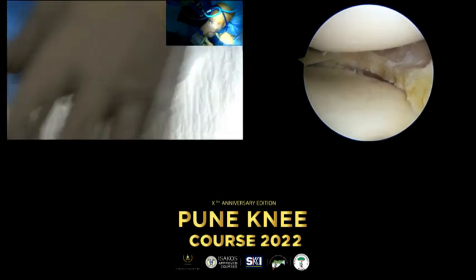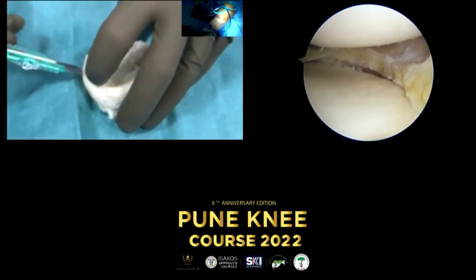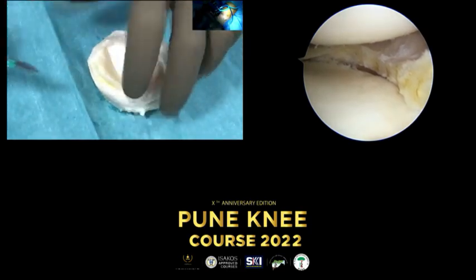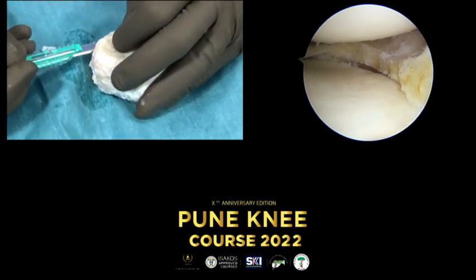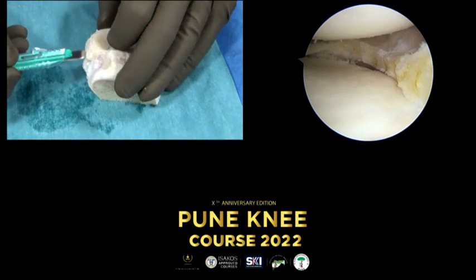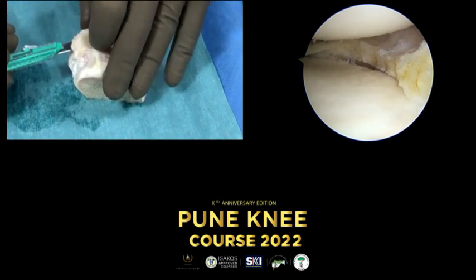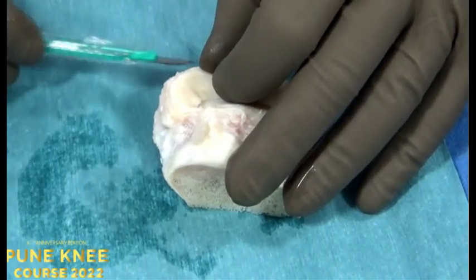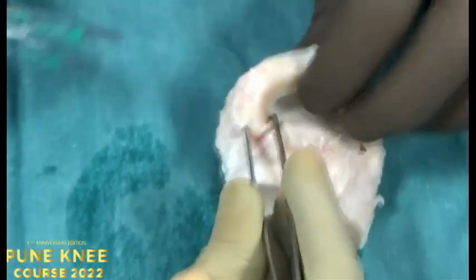So you can see here, it comes with a medial plateau. I prefer it this way because I prepare it. Otherwise, usually the people from the tissue bank don't do it as accurately as I like, which is having the whole anterior and posterior horn, even detaching some part of the ligaments and the periosteum, because in that way I can put this soft tissue within the tunnel. That for me is very important. That's the reason, from my point of view, why root repairs fail the most. They don't have any tissue within the tunnel. We are relying on a meniscus over the tibia.